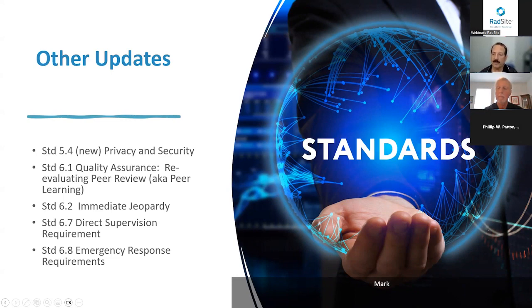No, I think you bring up a really important point. One of the things that we find is a lot of these facilities have multiple CT scanners, multiple MR scanners, whether it's at a particular facility or within their network. And it's really important for the medical directors to determine which machine is appropriate for which type of study. A lot of sites have multiple different machines, multiple different technologists, and they have the ability to steer some of the more challenging studies to particular systems.